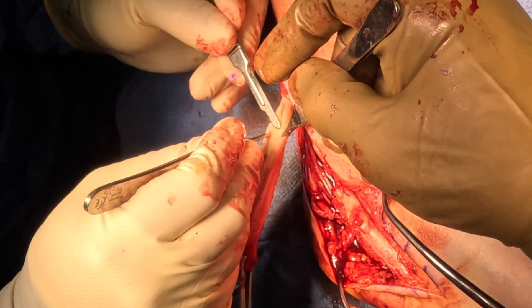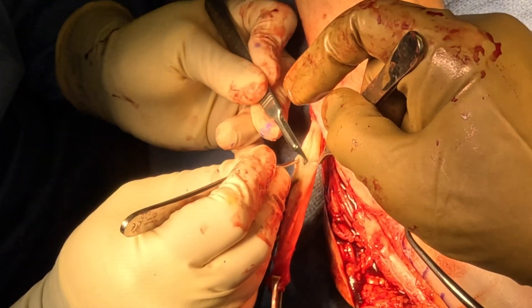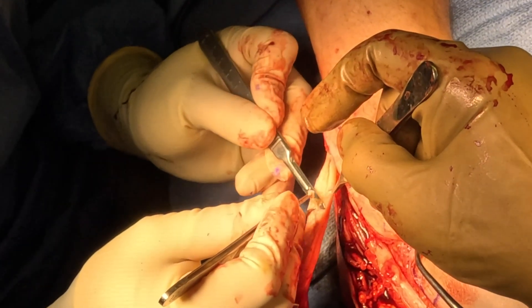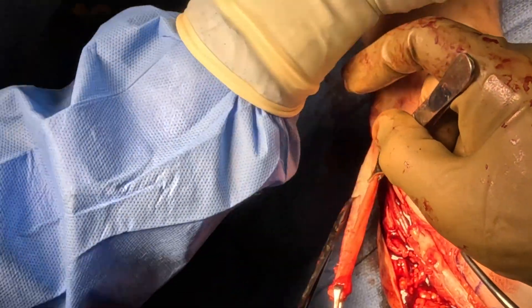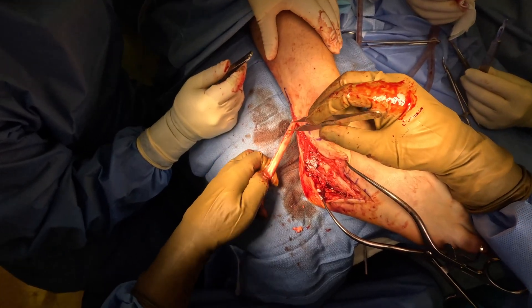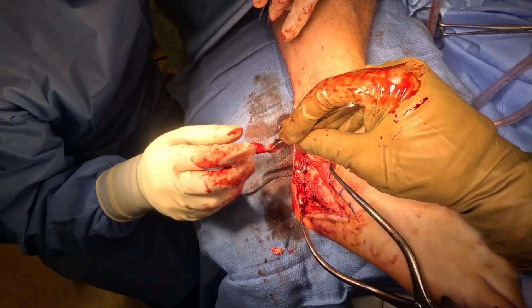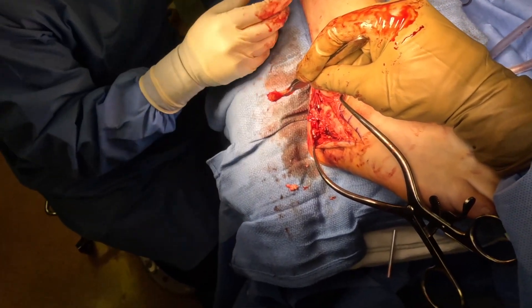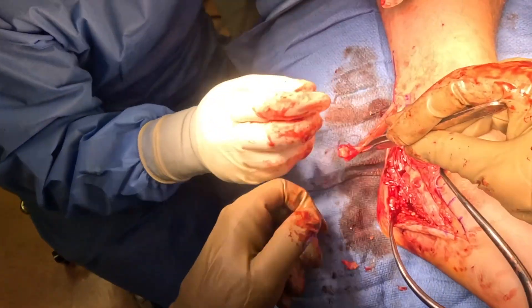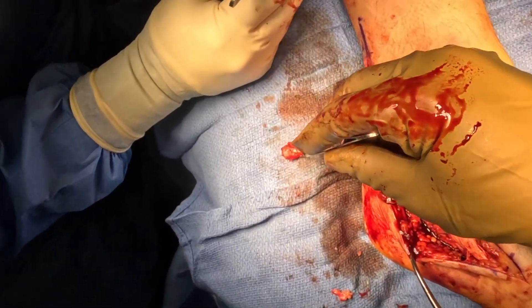We're making a longitudinal incision into the longus tendon. Within the tendon, there are two portions of large bulbous-like tissue. We're going to excise those from the innermost portion of the tendon — debulking it, tubularizing it — and then wrap suture around it to make it one nice straight tendon. As we were dissecting around it, we found the os peroneum, a bone encapsulated within that tendon, and that was the culprit of this rupture. That small bone eventually caused inflammatory changes that led to the tendon rupturing.